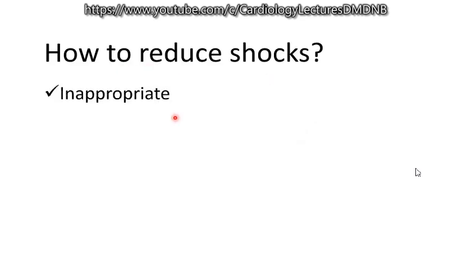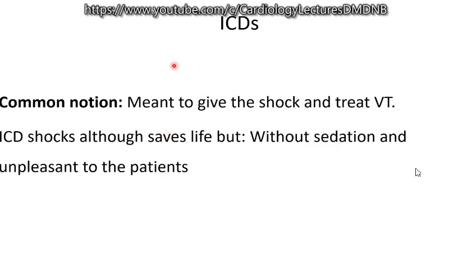Most important is both inappropriate and the appropriate. So wait a minute, why am I talking about reducing the appropriate shocks? Because the notion is the device is given to give the shocks. We have implanted the ICD so that the device can give shock and save the patients. So the commonest notion is it is meant to give the shock and treat VT.